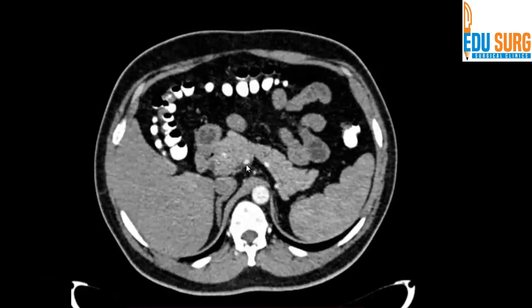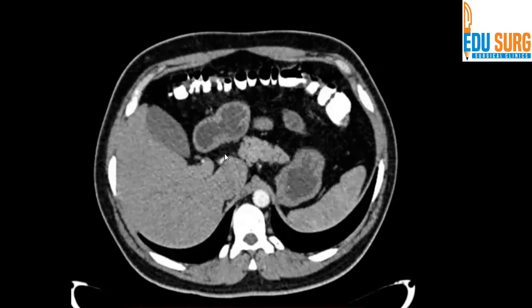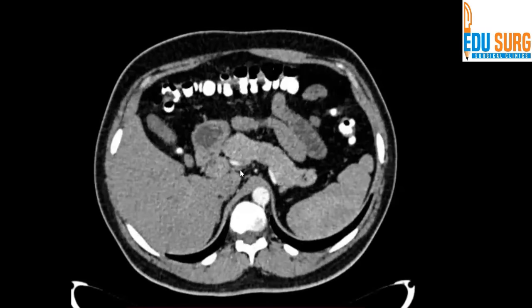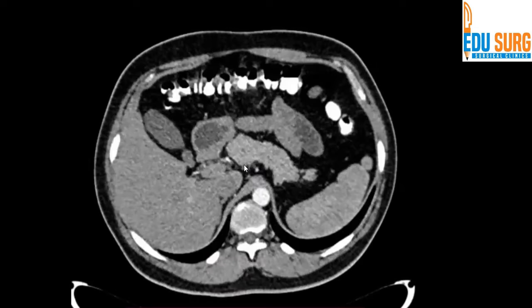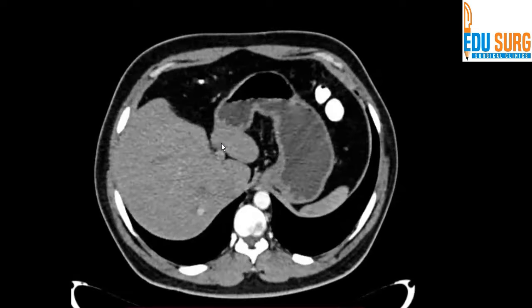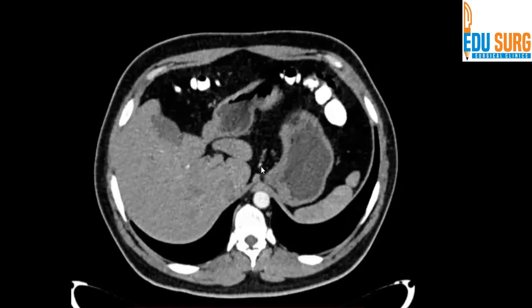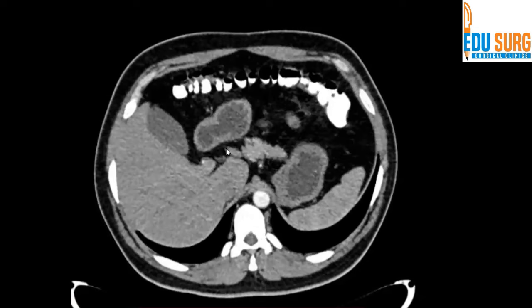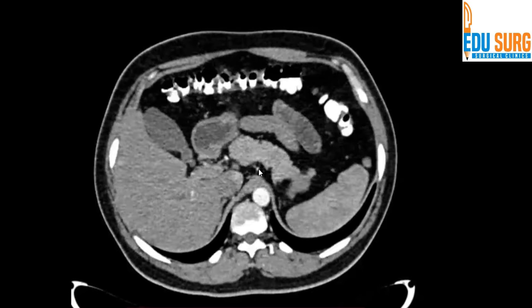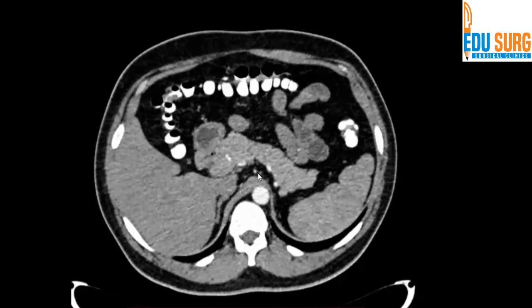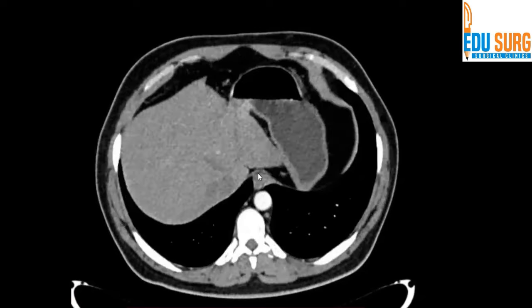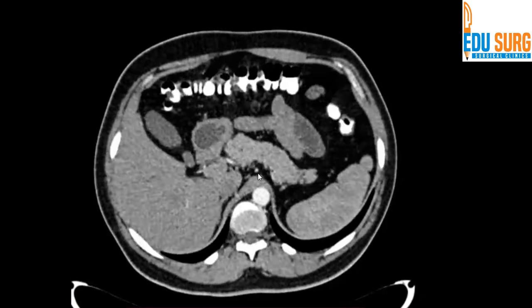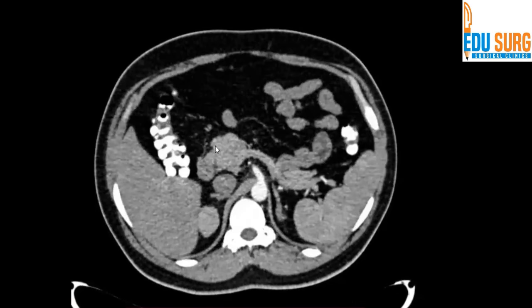Then you look at the arterial anatomy. This is the celiac. That is the hepatic artery. As you trace the artery on the liver side — that is the hepatic, going towards the celiac — but the left hepatic is not coming from there. The left hepatic is coming from the left gastric, right here. Trace this vessel. The left gastric opens into the celiac right here. So left hepatic is replaced. Right hepatic is coming from the celiac. That is the GDA, gastroduodenal artery.